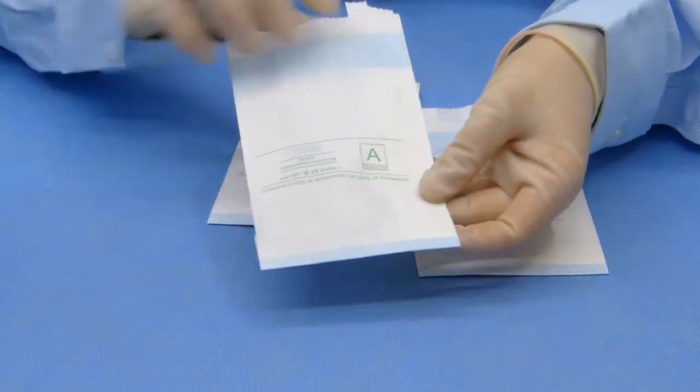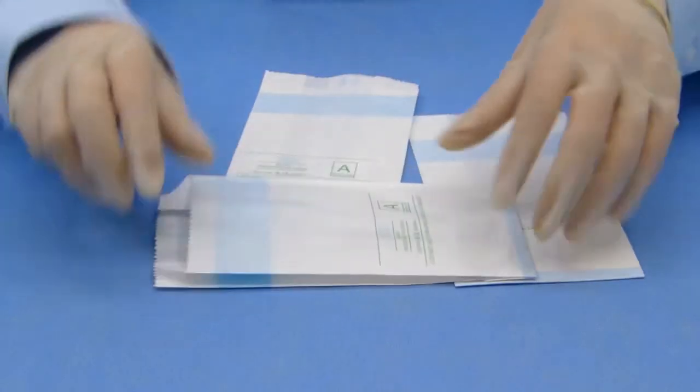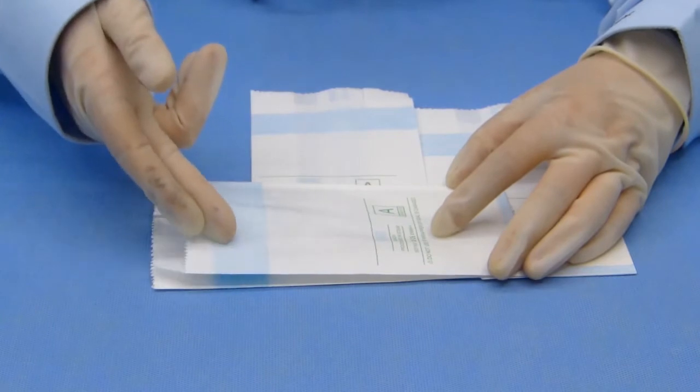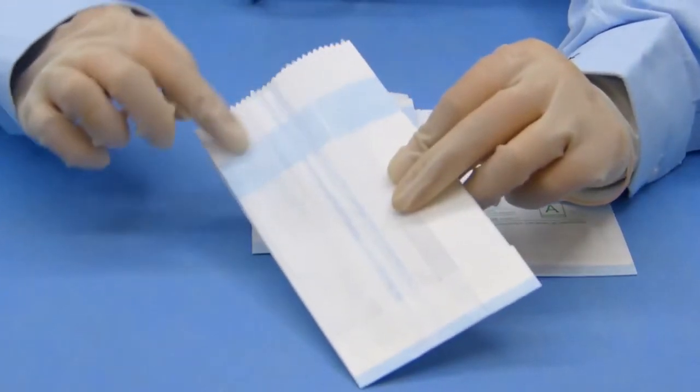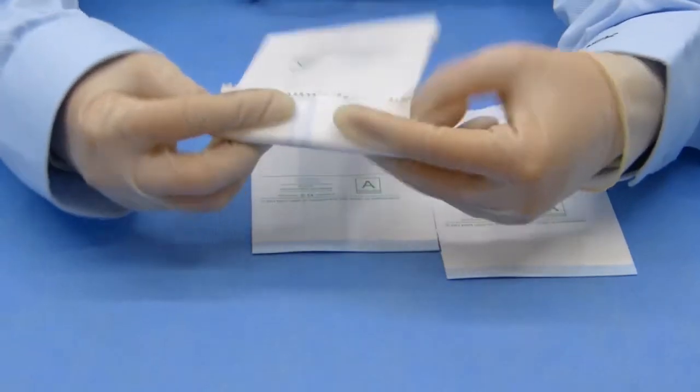Paper bags can either be heat sealed, or sometimes the top of the bag is folded over three times to create a barrier to microbes and then sealed with sterilization tape.